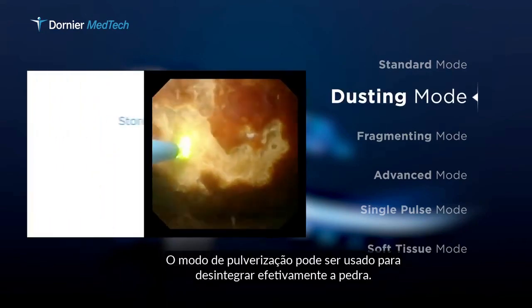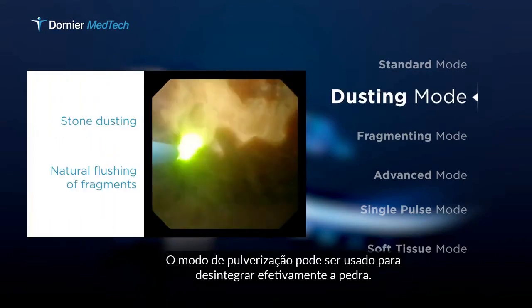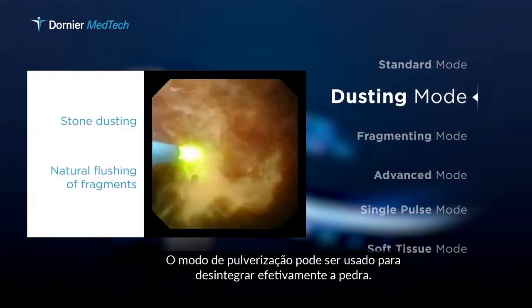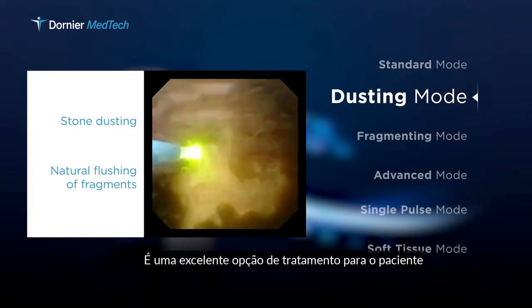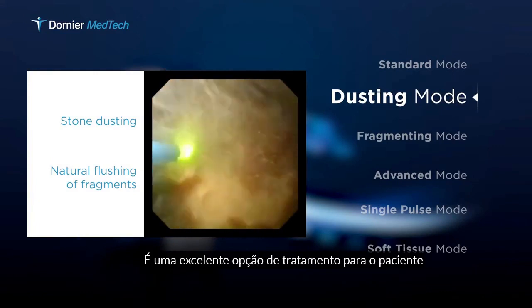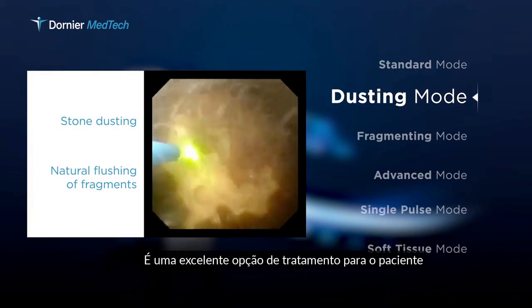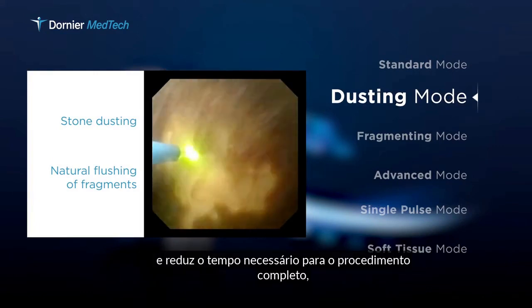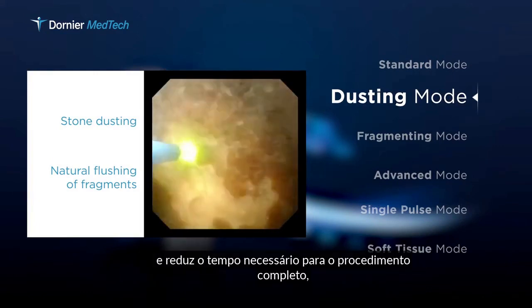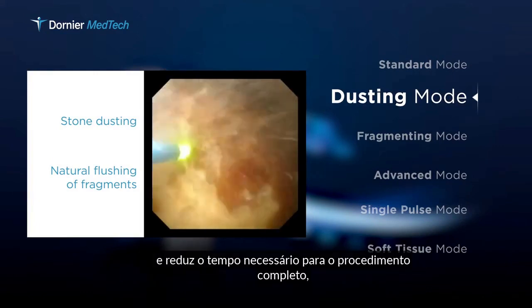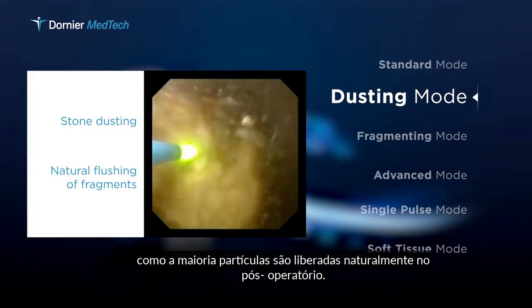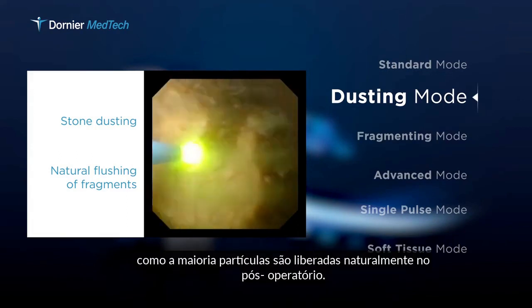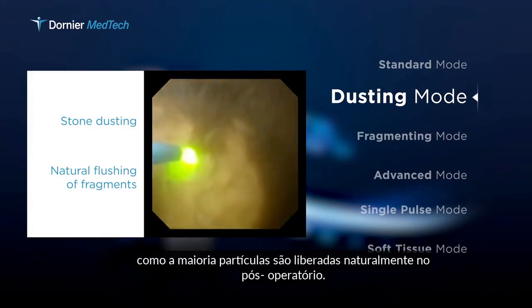The dusting mode can be used to effectively disintegrate the stone. It is an excellent treatment option for the patient and reduces the time required for the complete procedure, as most particles are flushed out naturally postoperatively.